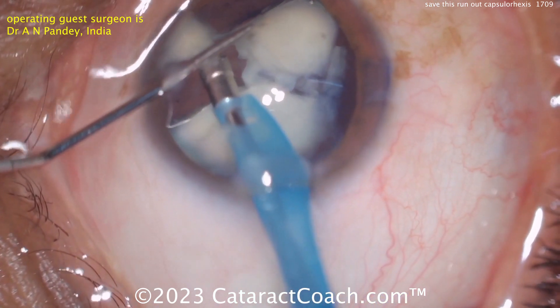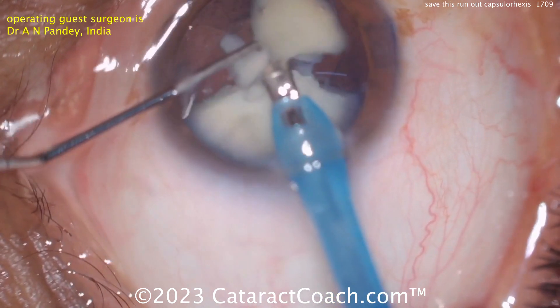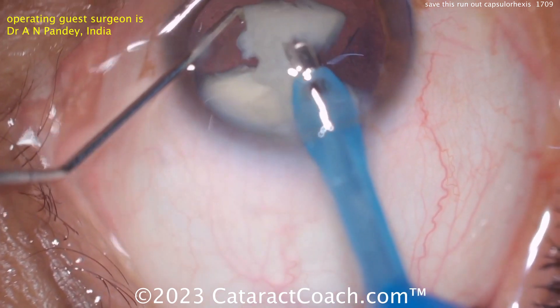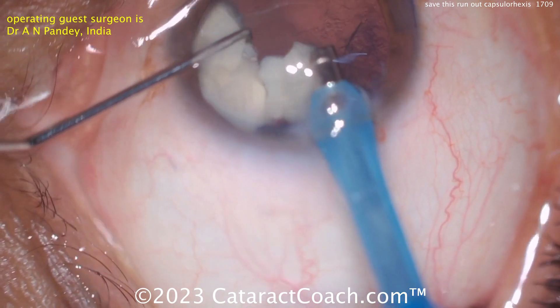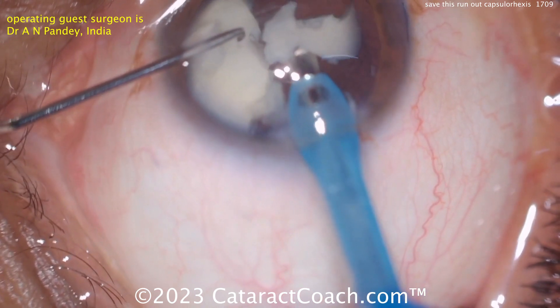Nice chop technique here, taking these nuclear pieces down. Then what would you do for a lens here? Would you do your standard single-piece in the bag, or try a three-piece lens which gives you more options if upon IOL insertion the capsule rips open more or there's less support? All reasonable options.